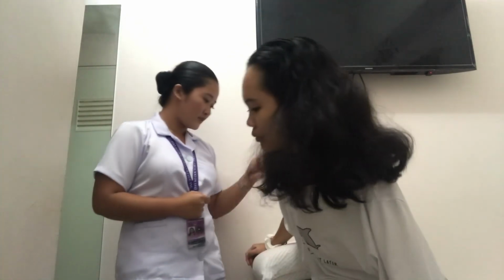Prior to conducting this procedure, I have already checked my equipment to see that it is clean and well functioning. I also have the correct size of cuff that I need for my patient, and of course I inspected my patient for any injuries, cast, bandages, intravenous infusion, blood transfusion, or any arteriovenous fistula, which could hinder me from taking her blood pressure in that particular limb. Ma'am, can you move to this side, please?